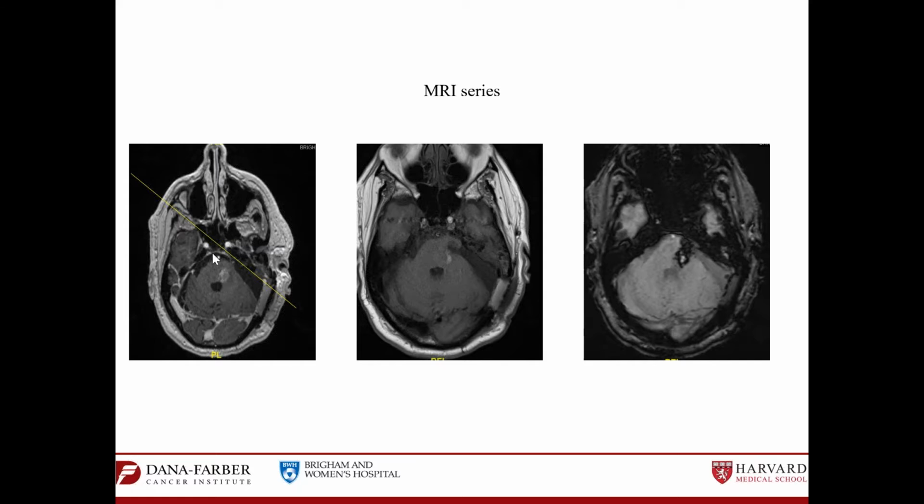Yes, we can. Okay. Now we want to know if that's residual disease after the surgery, or post-surgical changes, blood products and that stuff. So we pull up the T1 pre-contrast and look at the same cuts. Thin cuts on T1 pre-contrast are the best.